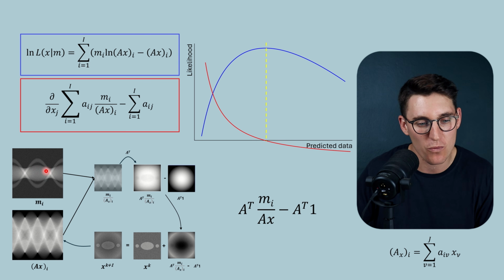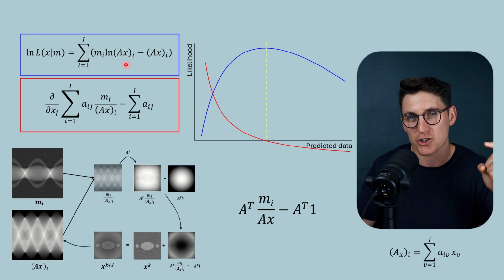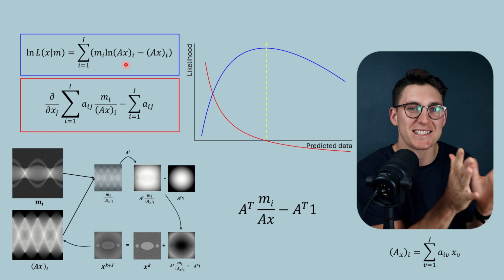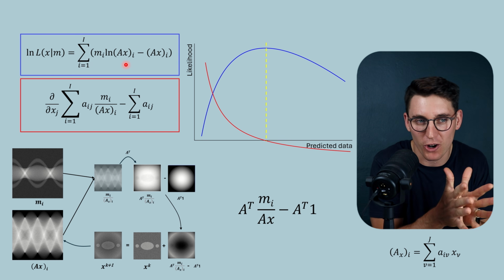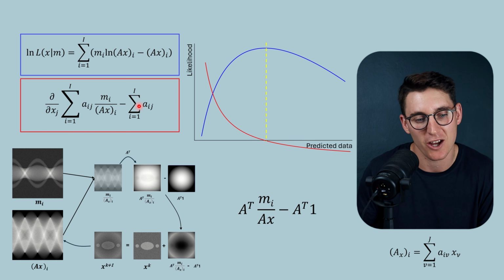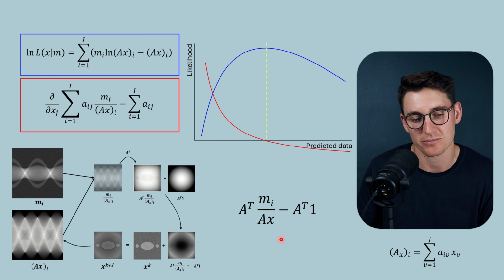We're not going to overfit the data. These formulas prevent us from overfitting the data and introducing noise into our estimated image. Because we're applying a system matrix that accounts for that geometry, we're also not going to get that geometric blur. We're also not going to get partial volume averaging because of the fan beam that heads out towards our detector. All of that is accounted for in the system matrix here.